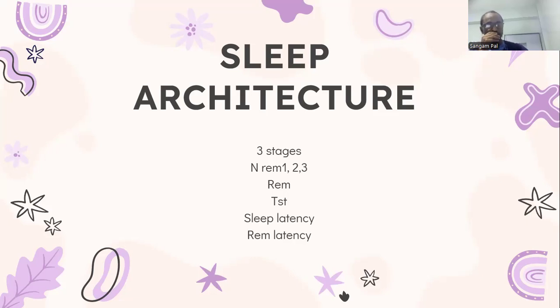Then in the sleep study we see total recorded time, which is from when the technician says lights out and go to sleep until wake up. In EEG we see total sleep time, and its percentage of the recorded time is called sleep efficiency.